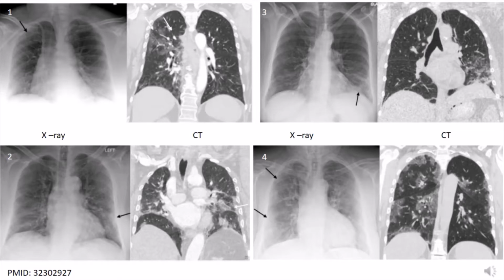Chest radiography is a less sensitive modality in the detection of COVID-19 lung disease compared to CT, with a reported baseline chest radiography sensitivity of 69%. The most common reported chest radiography and CT findings of COVID-19 include lung consolidation and ground glass opacities. Ground glass densities observed on CT may often have a correlate that is extremely difficult to detect on chest radiography.